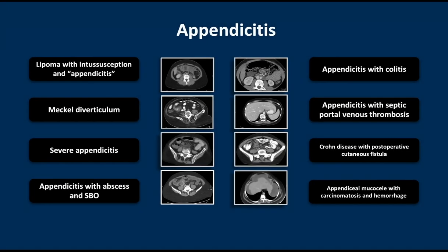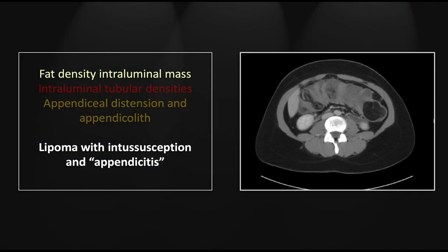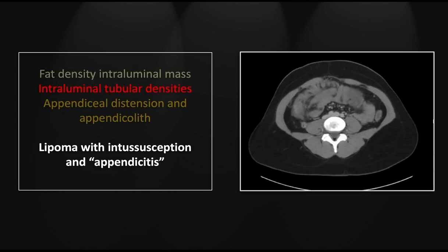Our first case is a large lipoma with an associated intussusception and pseudo-appendicitis. There is a large fat density mass within the lumen of the colon, and there is a large vascular pedicle with mesenteric fat dragged up into that lumen — this being the intussusception.